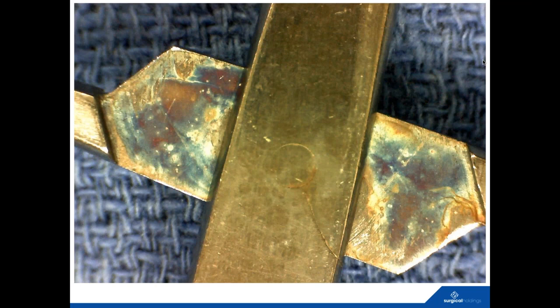So stress corrosion on box joints, again, you need to use lubricant, or you can get this scenario where you get obviously a crack appearing on the device coming away from the rivet. And yeah, if we use lubricant, it will reduce the risk of that. This is common. This is quite common on instruments.